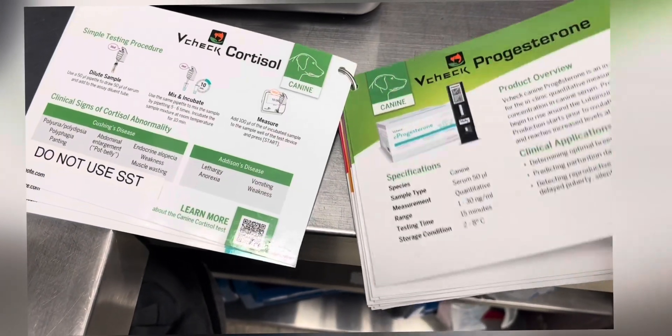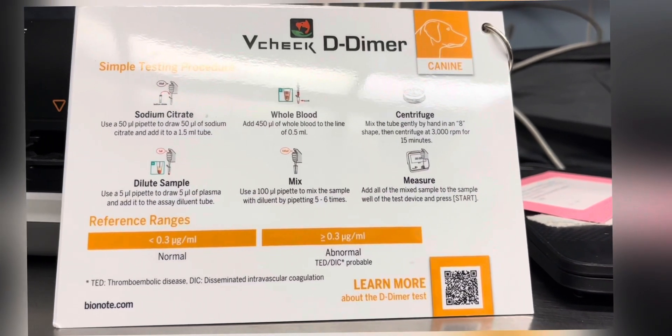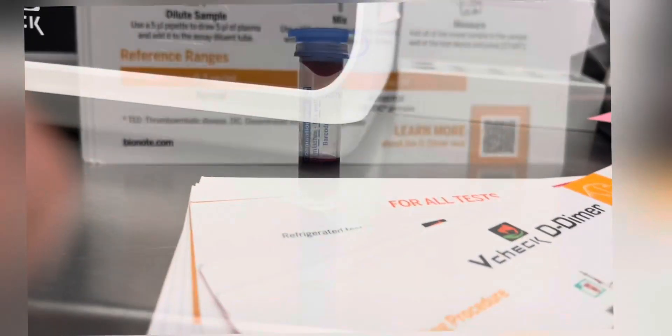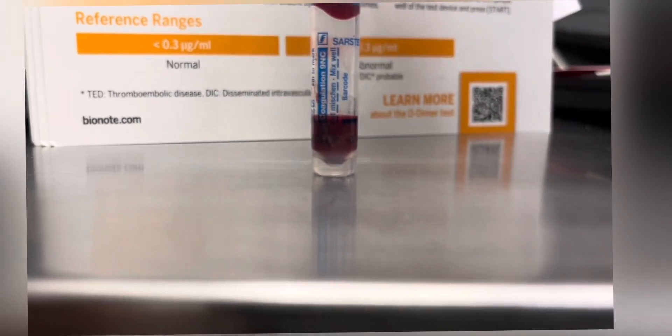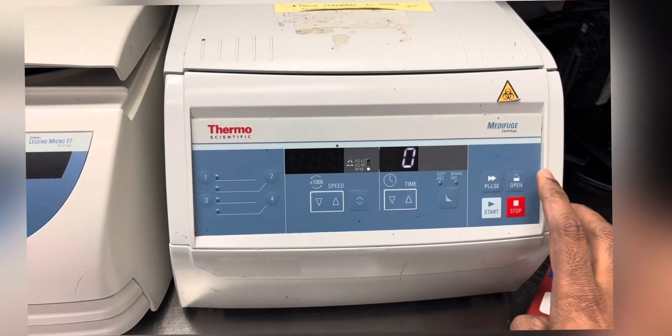For demonstration purposes today, we are going to do a D-dimer test. For that, we need 0.5 mils of blood. It has to be collected in the blue top sodium citrate tube and it has to be centrifuged.